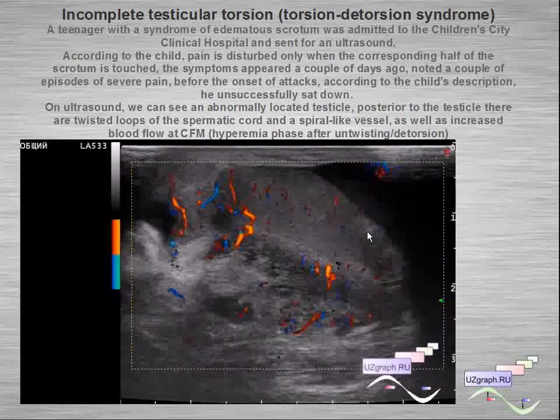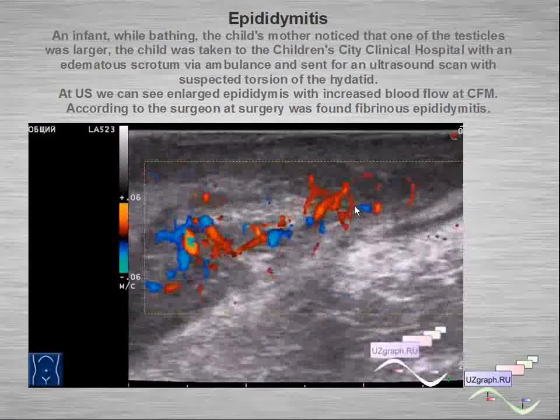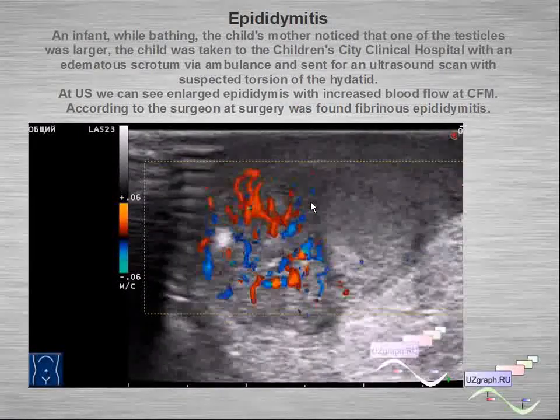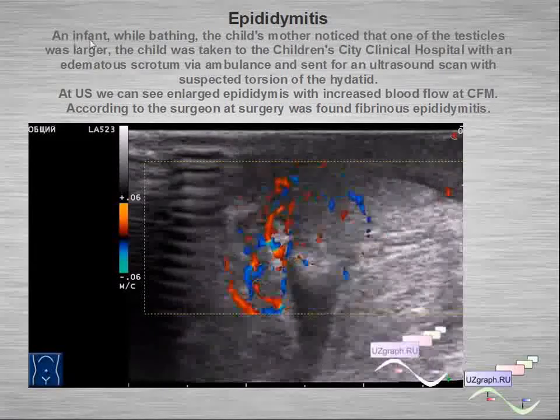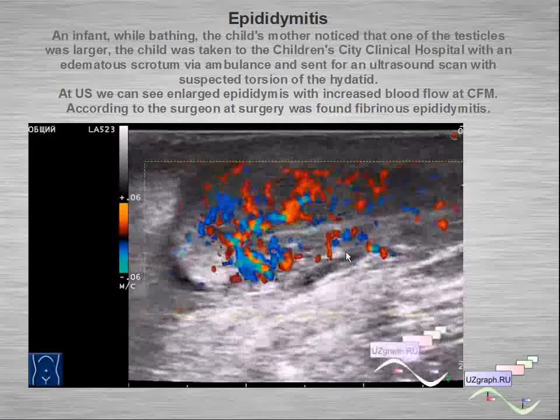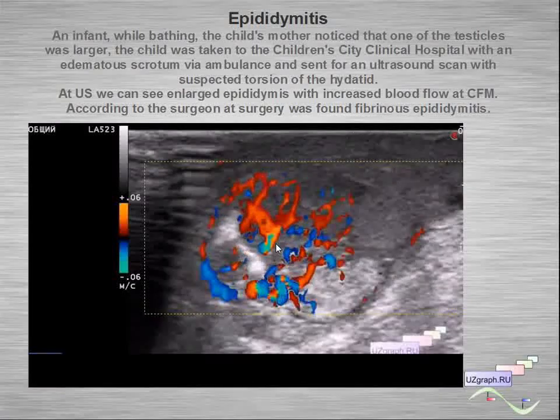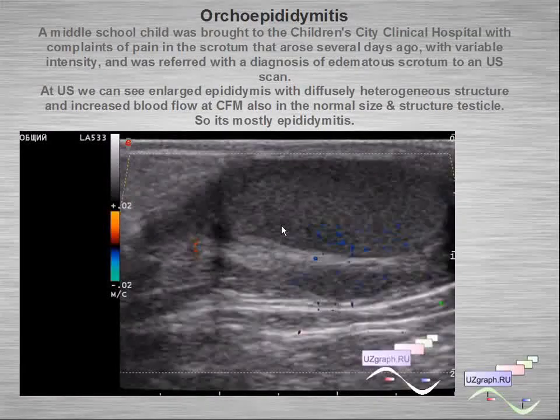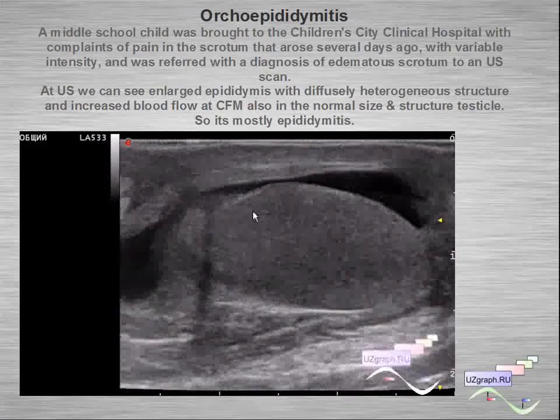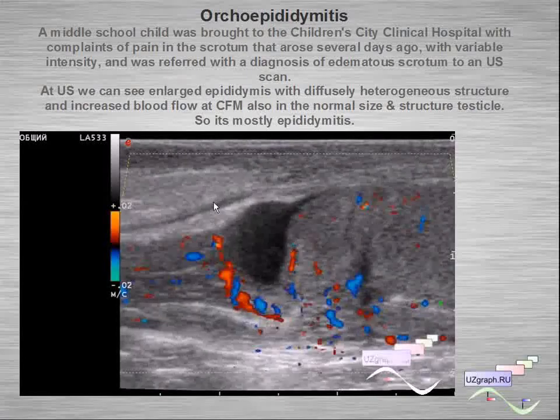An example of epididymitis: an infant with enlarged epididymis and increased blood flow in color flow mode. Another example of orchido-epididymitis with a mostly enlarged and heterogeneous epididymis, with increased blood flow in the epididymis and testicle.